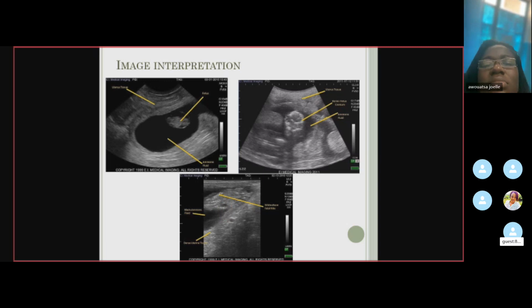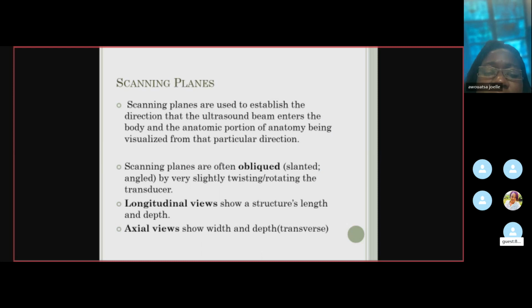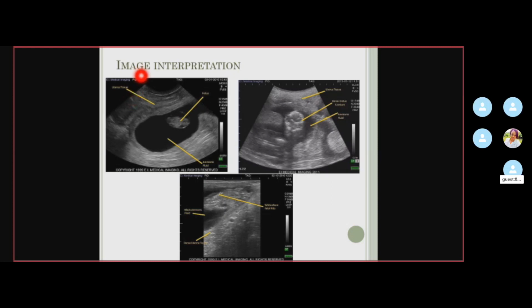One more difference you can see in this picture. See the top part of the image. It has a curved area. Whereas in this image, we have used a convex transducer, and here we have used a linear transducer. Why? Because it is a rectangular area. Rectangular.